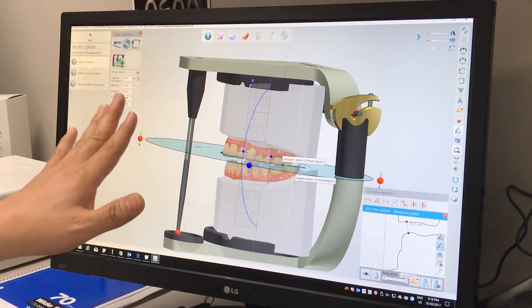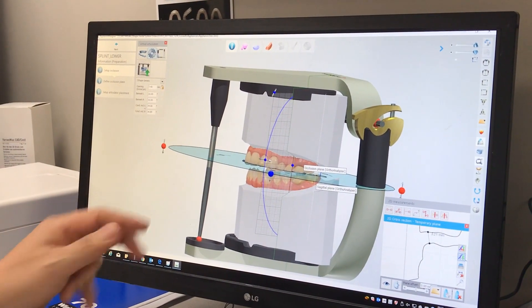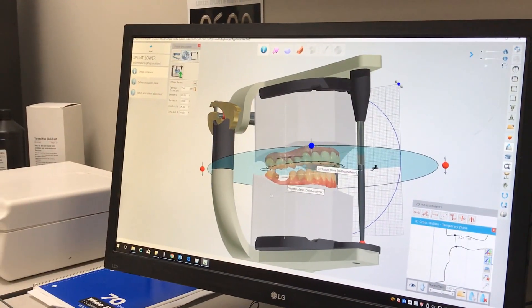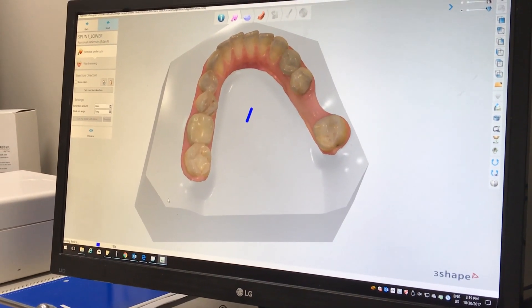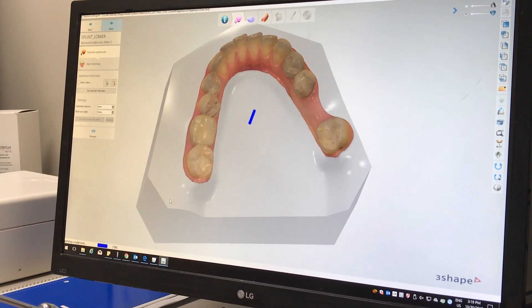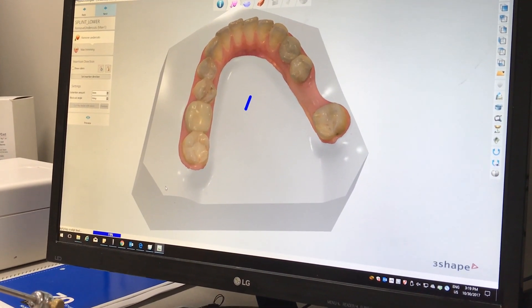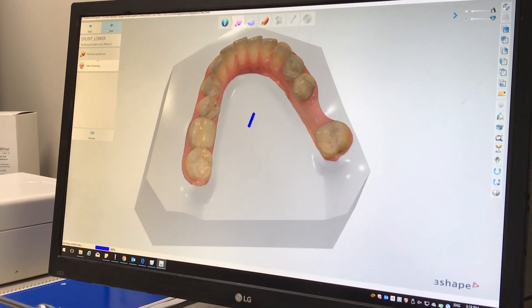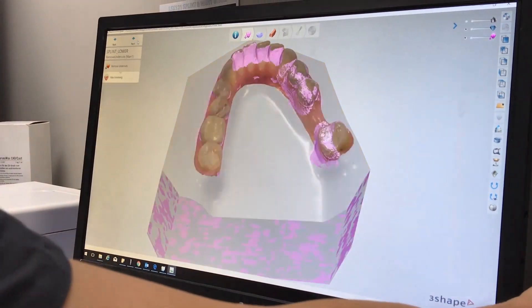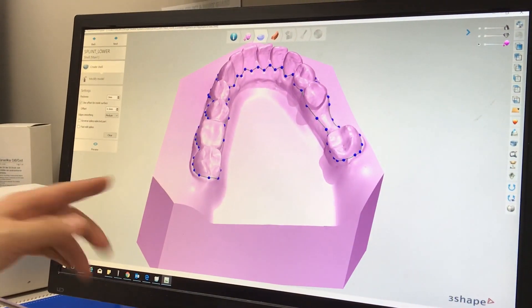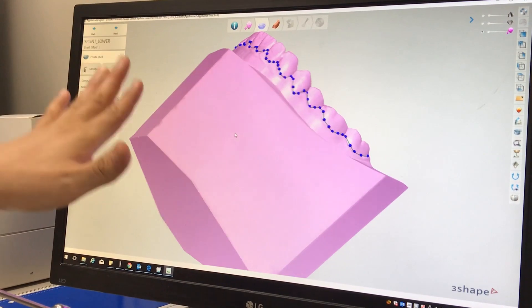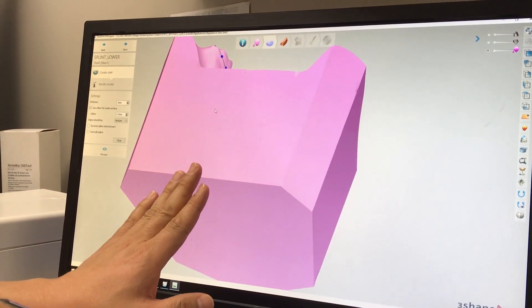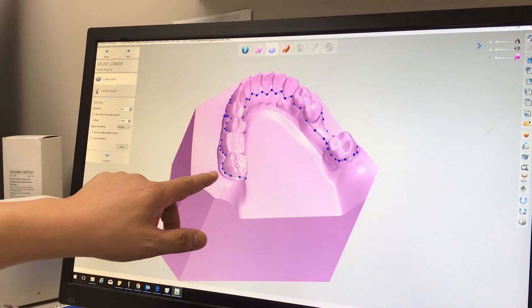Not only this — talking about design from STL files: whoever has an intraoral scanner, they simply scan upper and lower and send it to us. The scan was from a 3Shape Trios, and we can accept it. We also accept 3M, Sirona, E4D. Look at this design — it's so clean. Not only that, we design with a retainer as well, an orthodontic retainer.